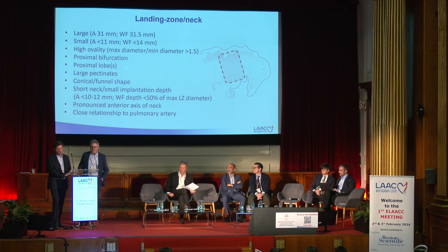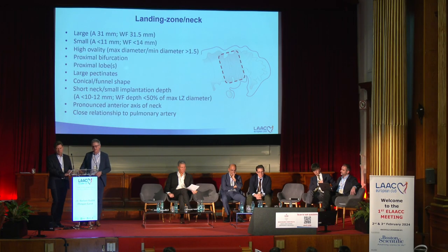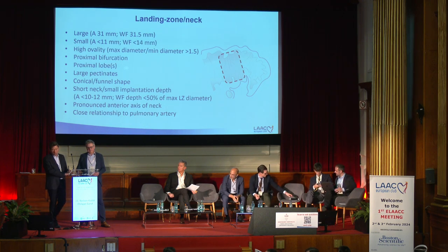I get your point, but personally, I have never experienced a compression of the circumflex artery, even with a stent inside the circumflex artery. And I think it's very difficult to predict whether you should stay away with your device or not. I don't think we have that information. We have tried systematically to measure this as well, and I can tell you that we have a lot of cases where we are extremely close with, for instance, the lobe of an Amulet device to the circumflex, and there are no clinical consequences. So I think it's in extremely rare situations. It's very unusual, I agree.